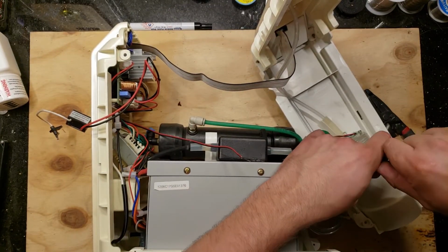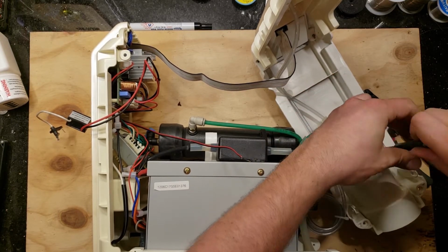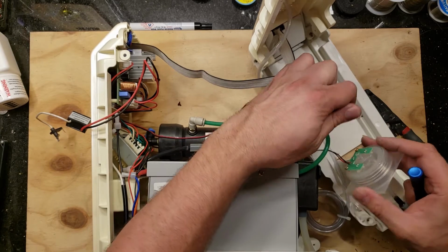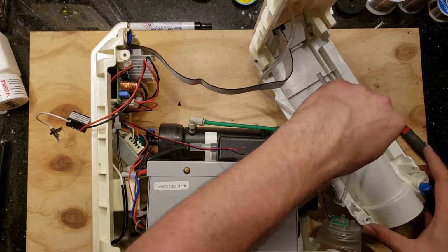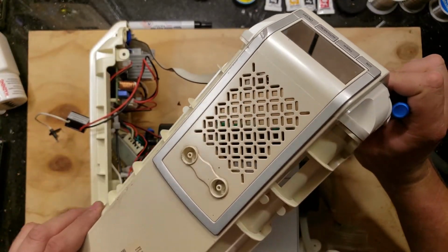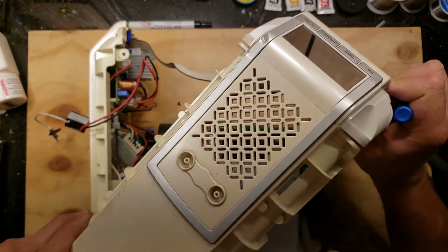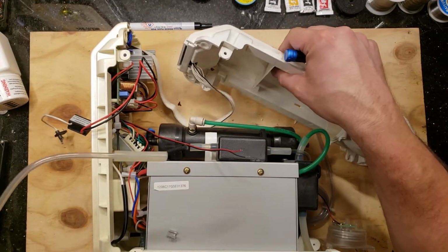Let's remove this little holder. Well, and of course the bubbler has to have some blue LEDs. I'm assuming they're blue. And actually this could be useful for something else. And let's see how we can take apart this thing here. Well, I guess since I'm not planning to reassemble it, I'm just gonna break this off.